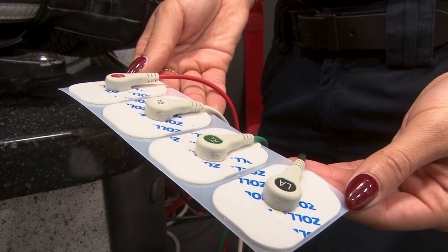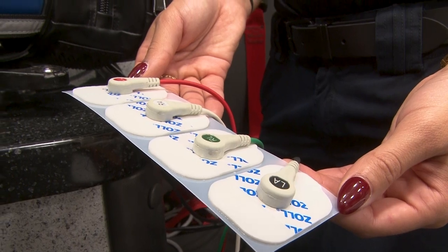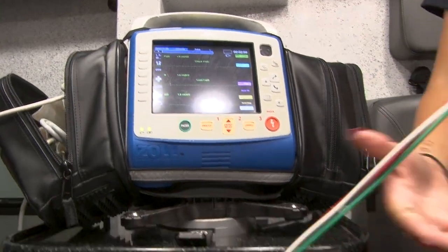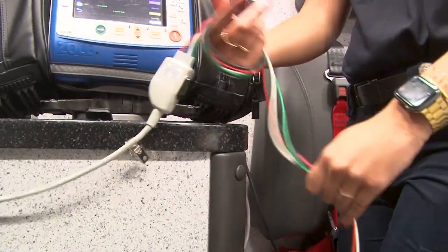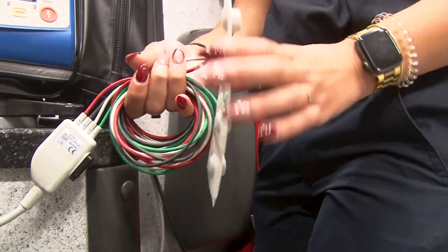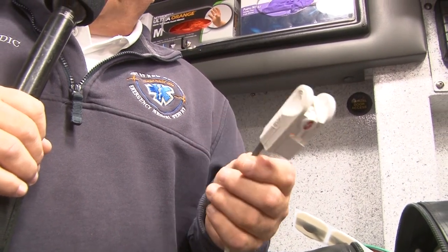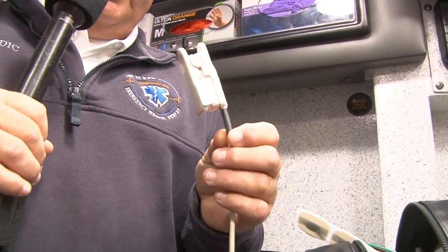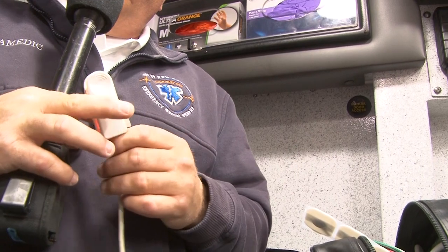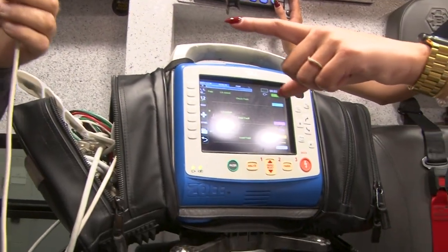So first thing they do when they arrive at the patient's side is they take this piece of equipment next to the patient's side. They will attach those leads to the patient's chest, both male and female, and they'll get a blood pressure on the patient. And they can also get a pulse ox on the patient, which is this probe right here. After they get a blood pressure and a picture of the patient's heart, they'll attach this pulse ox probe to the patient's finger, and they'll get a reading, and it will indicate how well the person is oxygenating, how much oxygen the patient has in their blood.